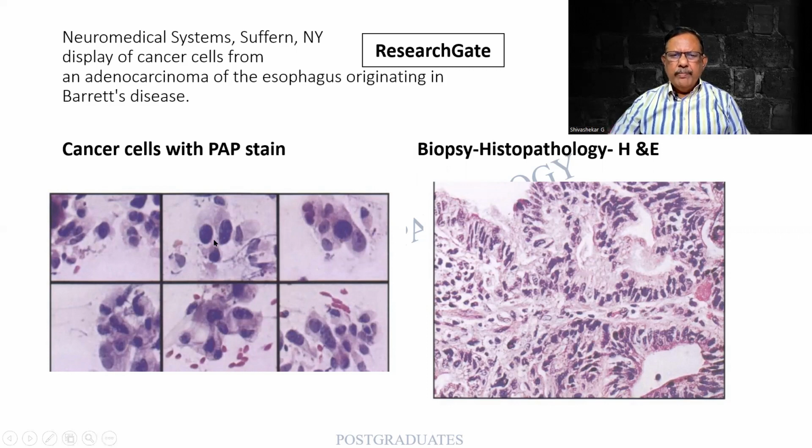There will be some cells which are difficult or atypical or somewhat suspicious, which could not be definitely diagnosed. But then what happens is at a later date, again thanks to Professor Narasimhan, this is called post-biopsy or post-histology wisdom. After having the histology, I go back to the cytology, whether I am able to or not, this is being constantly fed into the computer. So that one day, you find that the computer is more accurate than us, not that it is more intelligent.